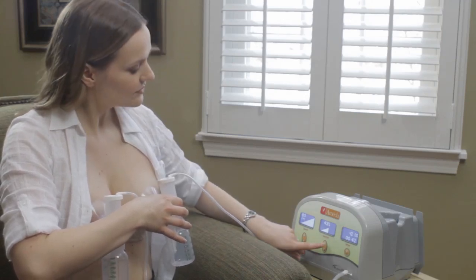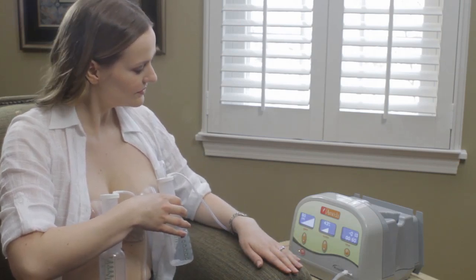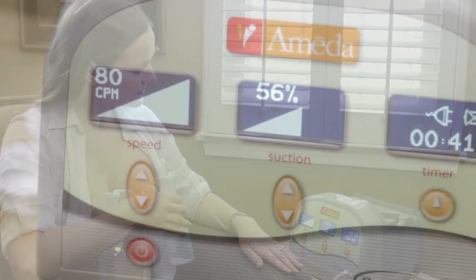With VacuSense technology, your pumped suction continues to stay at your chosen setting when you pump at different altitudes, even during single and dual pumping.